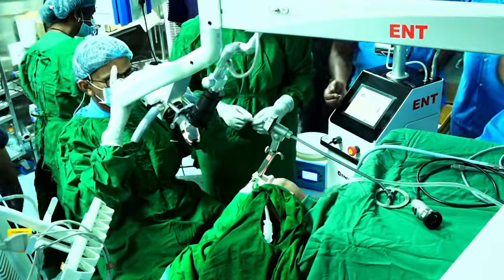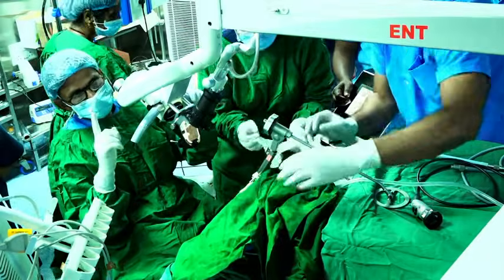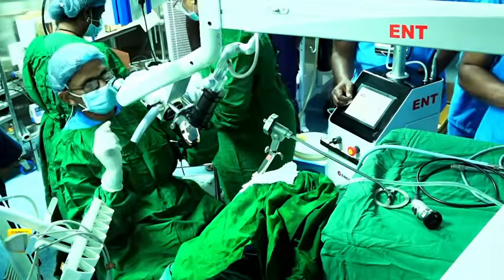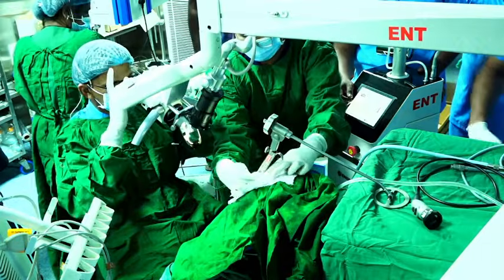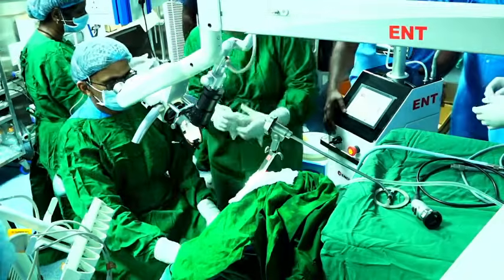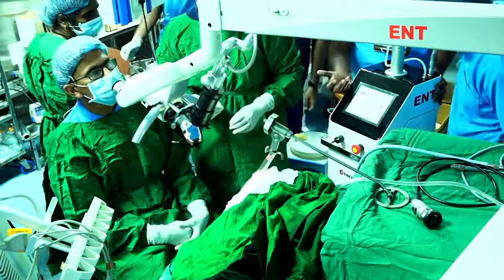And third is the mucosal trigone; avoid injury to the mucosal trigone. These 3 M's are most important, and these are the basic phonomicrosurgical principles. So you have to keep these 3 things in mind before proceeding with the surgery. And as much as possible in phonomicrosurgery, avoid injury to the anterior commissure and posterior commissure.